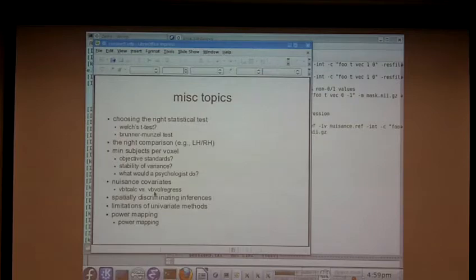So as long as you can pick two voxels and say, do these two voxels have an equally strong relationship with our dependent measure, that question can be answered. There are apparently methods for doing this in multiple regression as well, but they're very complicated and rely on resampling techniques. I don't know that they're that complicated. They're complicated to implement. And we certainly don't have implementations for imaging, so right now we can't do that.